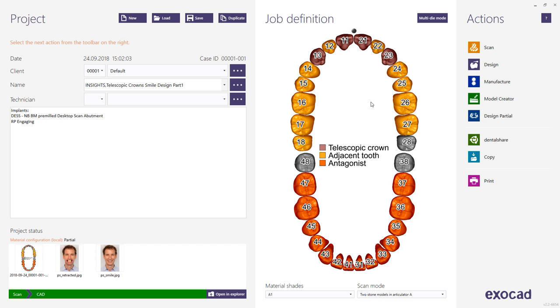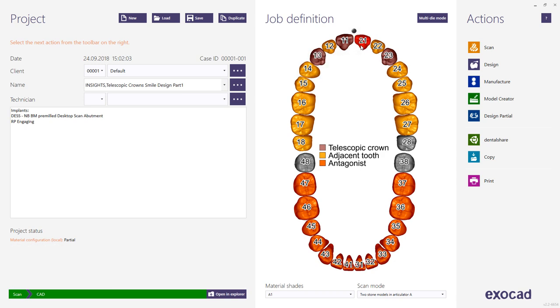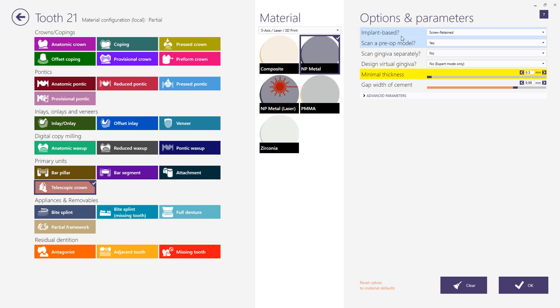Welcome to the third case for the ExoCAD Insights training sessions. In this case we will design in two sessions telescopic crowns and a removable partial framework with secondary crowns on the telescopes. In the first project we simply define the telescopes on the teeth. On tooth 21 we also have an implant, and we will define screw retained to directly design a telescope on the implant.